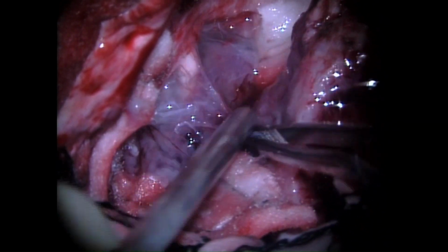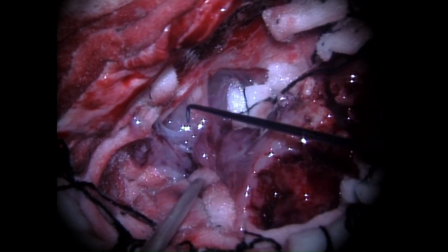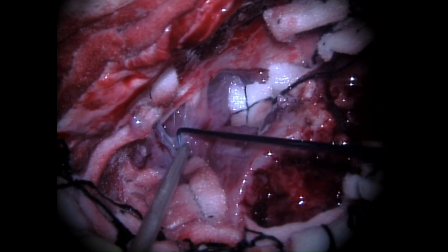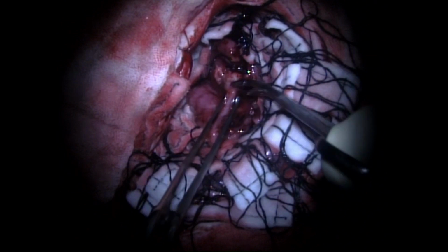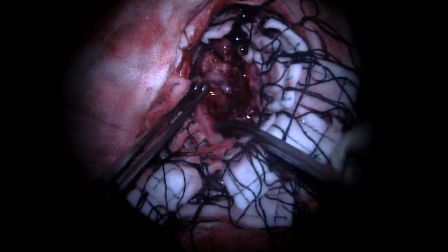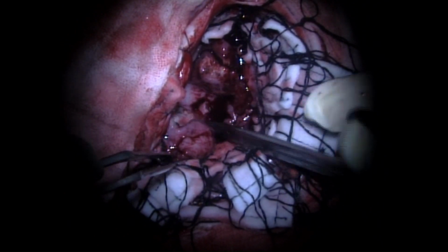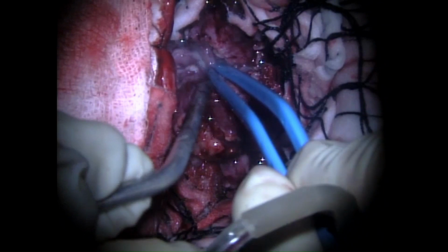Here you can see the arachnoid being dissected around the area of the optic nerve on the right side, and then using the arachnoid to deliver the tumor without causing any damage to the surrounding critical neurovascular structures.